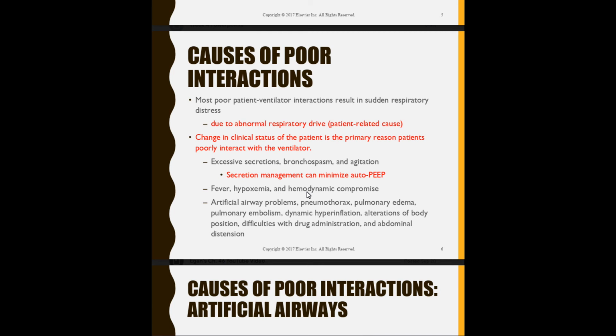We want to minimize the bronchospasms in the upper airways, so the upper airways are clear, so that even if I have an increase in static compliance, meaning to say my lungs are getting better and they can stretch more, and I can take in more volume, I can blow out more volume. So therefore, I will be able to ventilate out all that CO2. Okay, so clearing the upper airways, which involves secretion management, is going to help minimize your auto-PEEP.